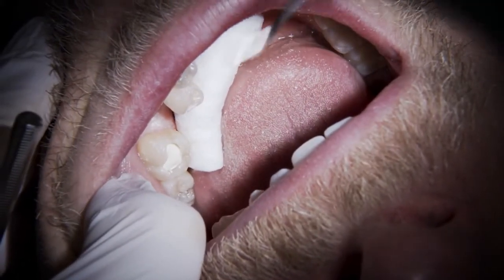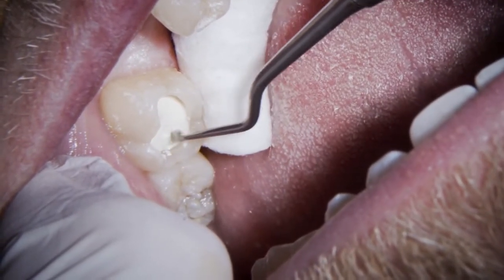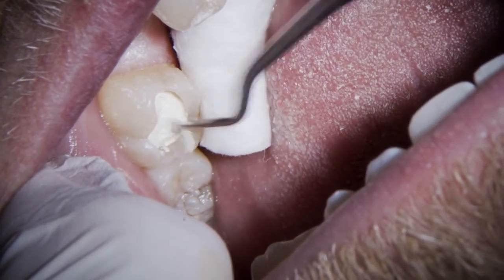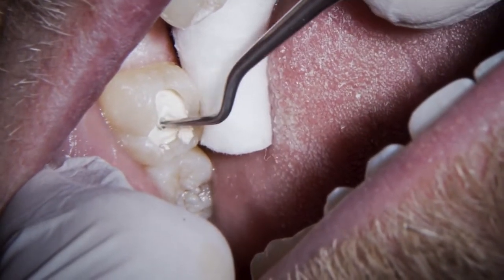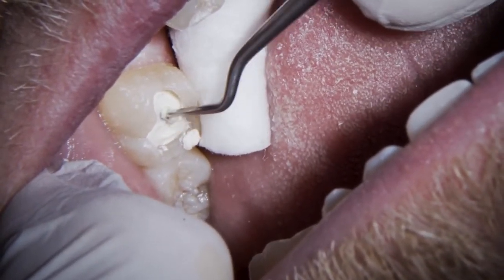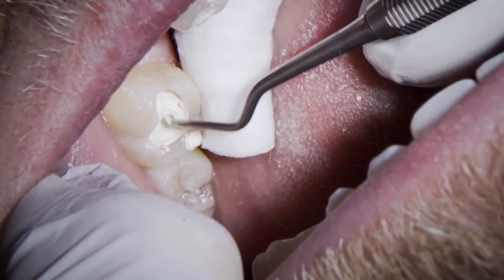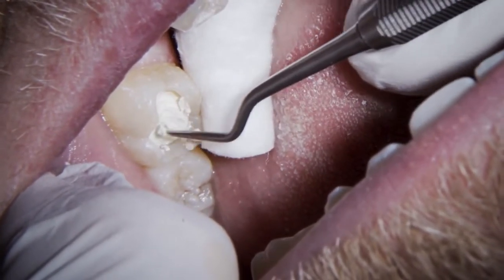We're just about 15 minutes since that material was mixed, so I'll go in and start to check it. It's still a little bit soft but I want to take it down and get some nice shaping where the fissure shaping would be on the surface. It's just really nice consistency to work with. I use an excavator to do any occlusal shaping, and a Ward's carver if we're down in a box and want to shape across the front. But really I try and get as much of the shaping in with that initial placement.